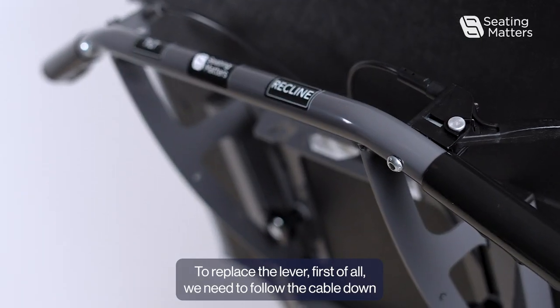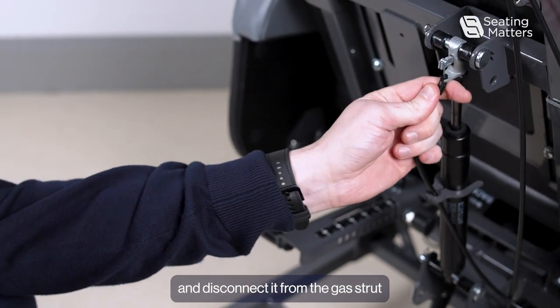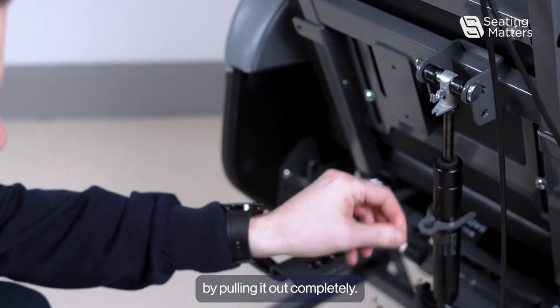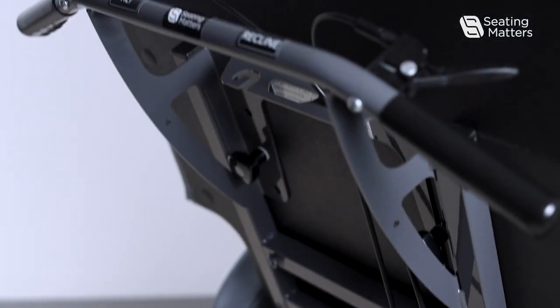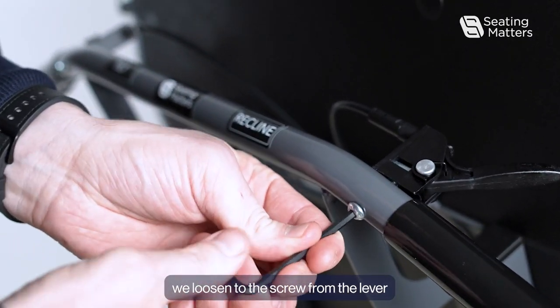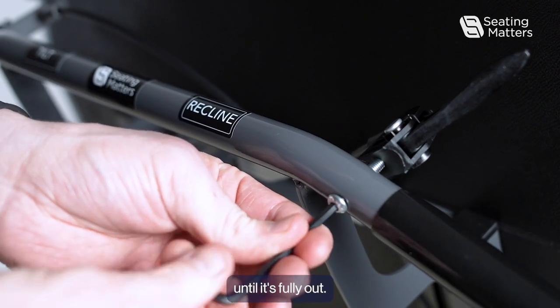To replace the lever, first of all we need to follow the cable down and disconnect it from the gas strut by pulling it out completely. Then using a 4mm Allen key we loosen the screw from the lever until it's fully out.